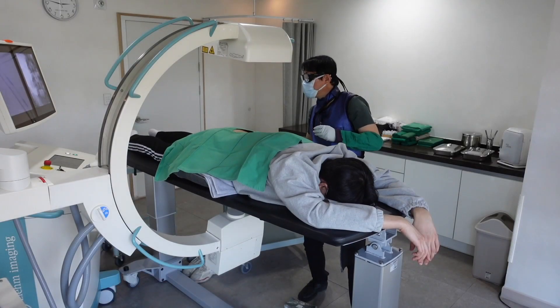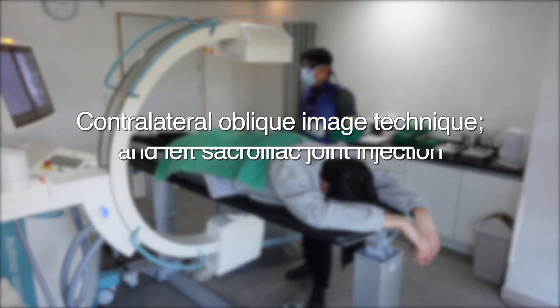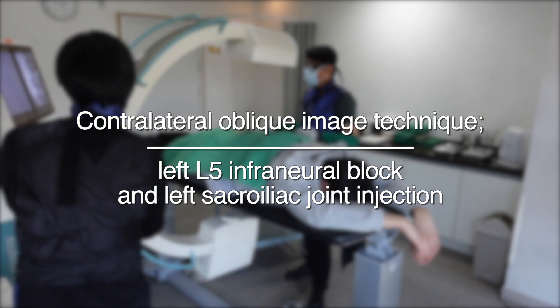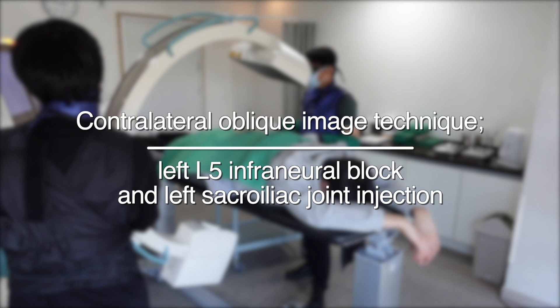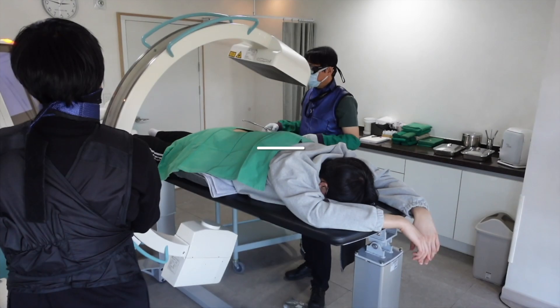Welcome back. We will learn oblique anatomy for the Left L5 Infraneural Transformer Injection and Sacroiliac Joint Injection using ipsilateral oblique, AP, and contralateral oblique image guidance.